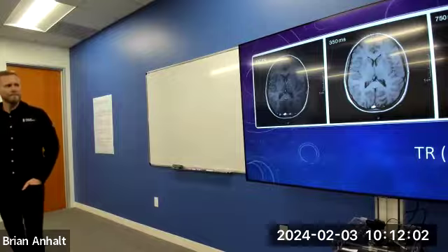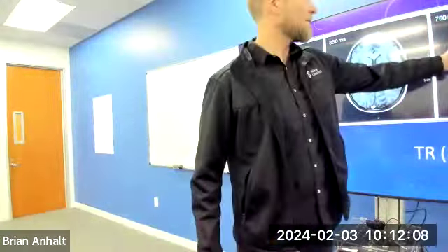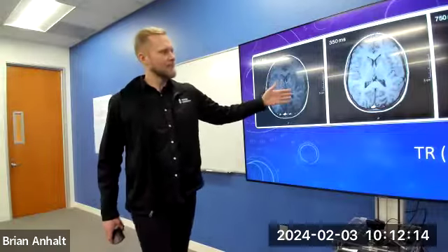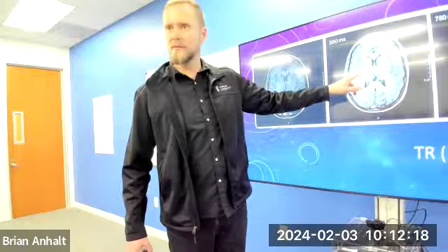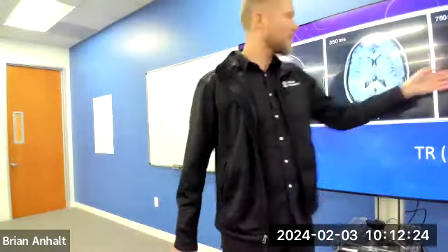There as well. 100 milliseconds, 350, 750, right? You can see the difference. Not much signal, right? Got my signal back. I have some pretty decent contrast there too. Go a little bit higher, still have contrast, not as much as here, but you can definitely see this one's not grainy at all. There's no grain in this one where you see a little bit in here. Right.